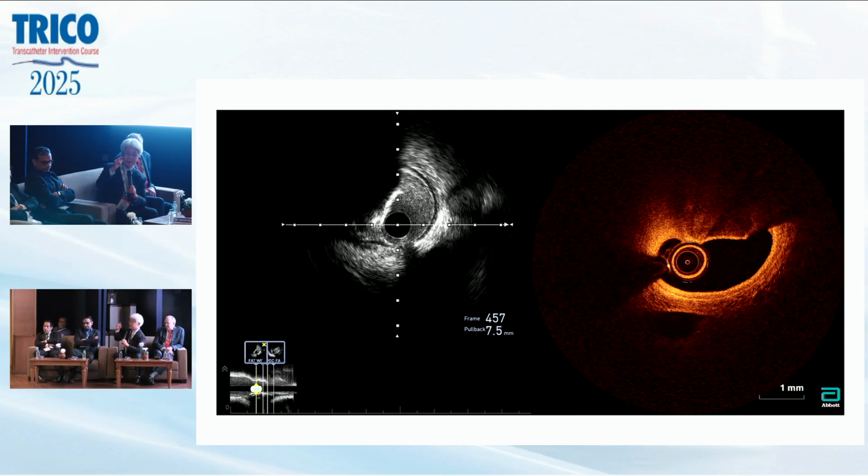And if you dilate directly by non-compliant balloon, because the opposite side of the calcium is completely normal, the balloon expands to the opposite side of the calcium, therefore there may be a risk of rupture. And even the balloon can rupture, right? Because of this sharp calcium. Yes.